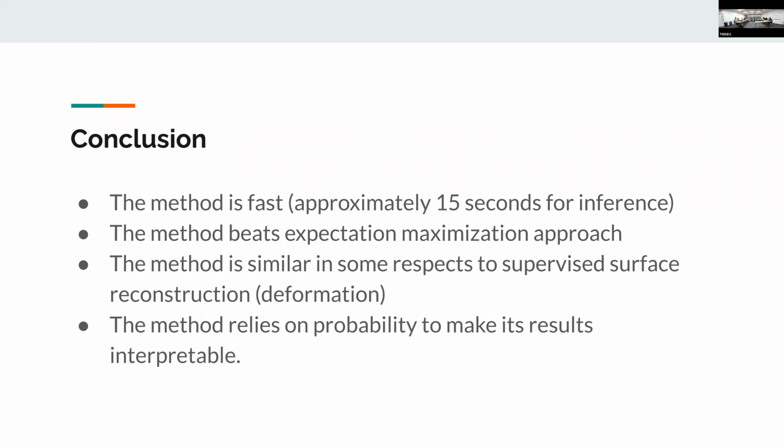Are they jittering those voxels? I think the second path through the network acts like confidence, to dampen certain segmentations from the atlas and let through others that were in agreement with the likelihood maps. It's kind of like a gate from an LSTM or a mask. You take the warped atlas and the likelihood maps and combine them to get the final segmentation.